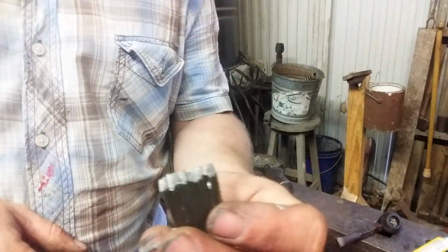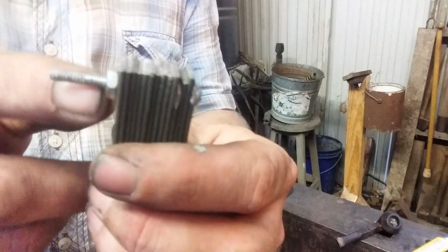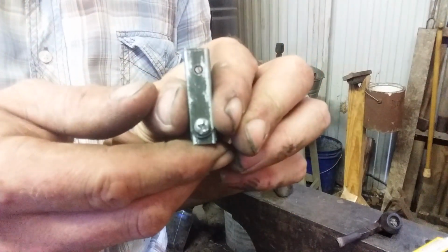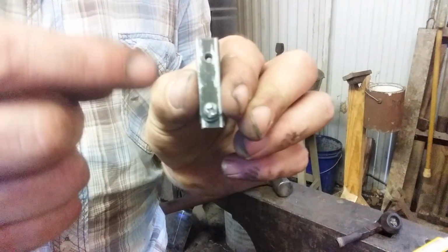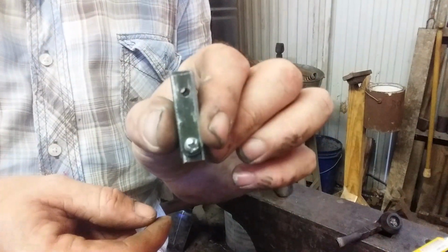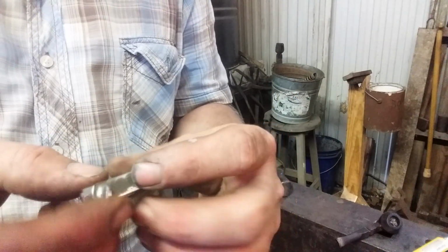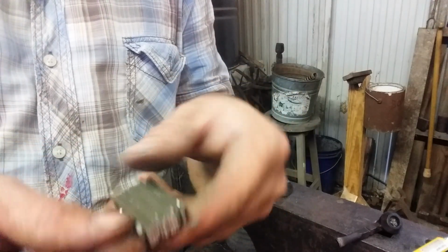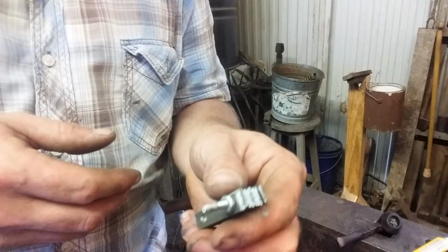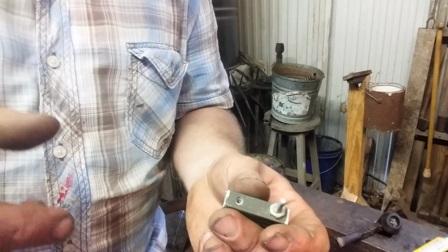Alright, what I've done here is I've cut all these pieces off, and I've securely tightened them with a bolt. So I'm going to go back to the drill press, and that hole's pretty good, but I'm just going to lock this in the drill press vise and go ahead and clean that hole up where everything will work real smoothly. Then I'm going to lock another bolt into it and keep them bolted while I grind the profiles. I think that'll save a lot of time and give us a little bit better quality of finished piece. So back to the press. We'll see you in a minute.